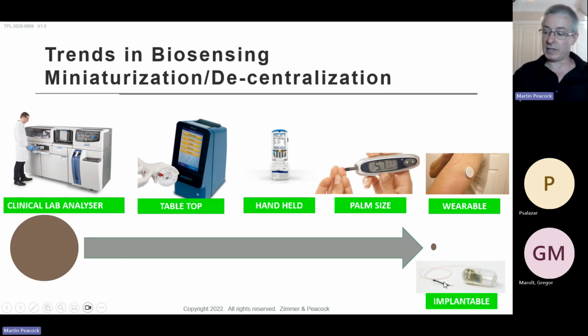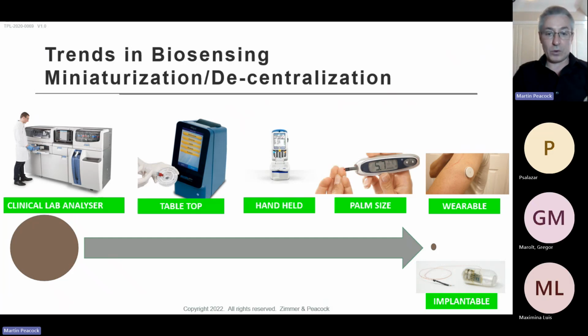But actually, I'll talk about a company called Senseonics. I have a slide on them. It's got to a point now where I thought, oh, well, we've kind of finished now. It's got wearable. But then you've got Senseonics, who I think may about have FDA approval for a 1 year implantable. So it's gone beyond wearables now. It's actually gone into implantable.